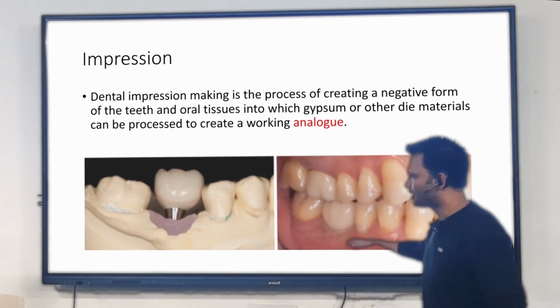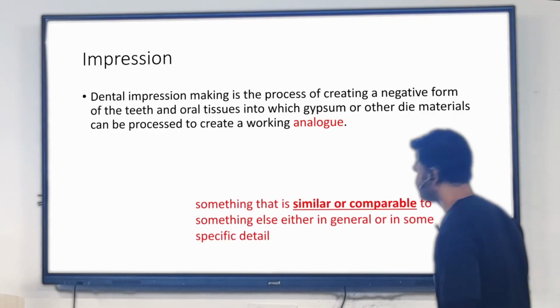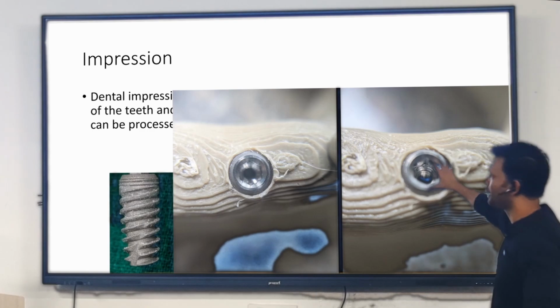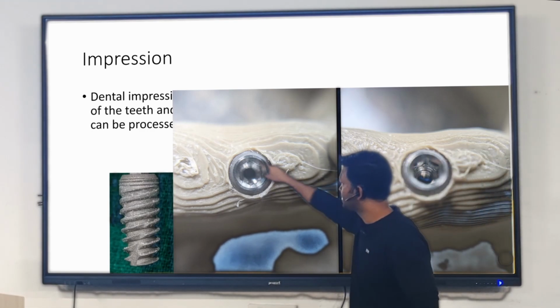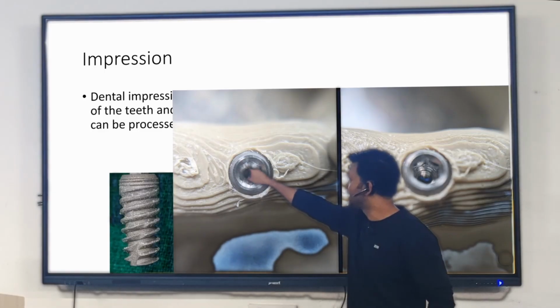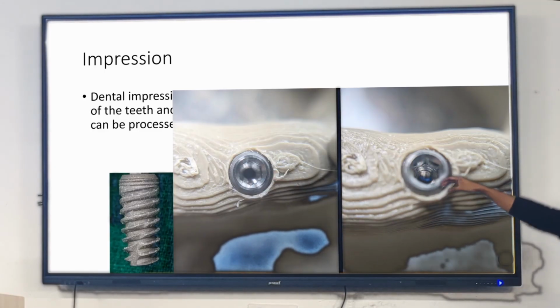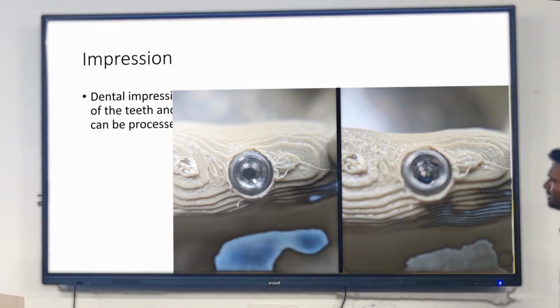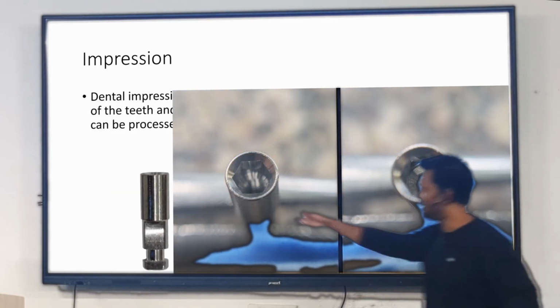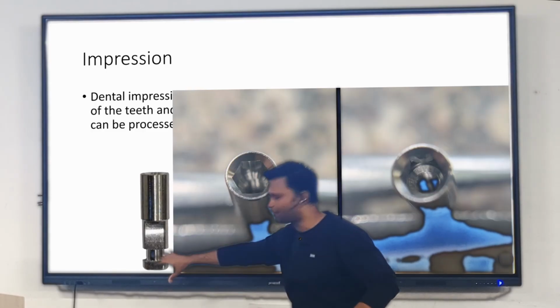So for that, we have something called an implant analog. Do you see the implant inside the 3D printed mandible? The outer surface has a hex connection, 6 sides, so it is a hex connection, whereas inside there are threads to receive a screw, right? Next, there's a dental implant analog. Bahar se the outer surface is different.